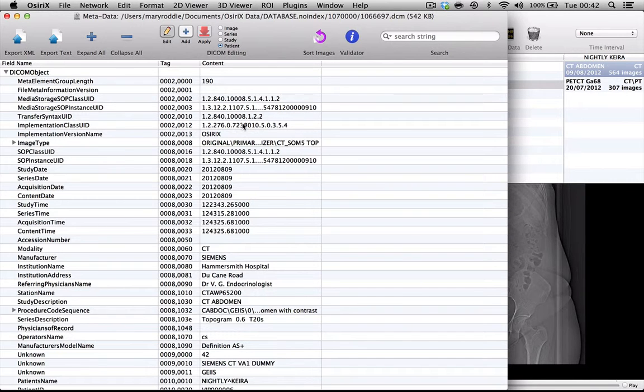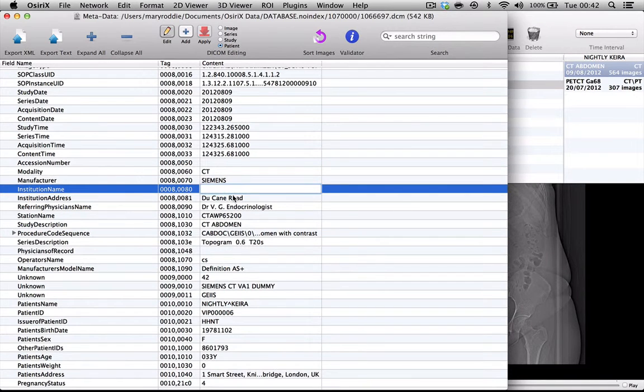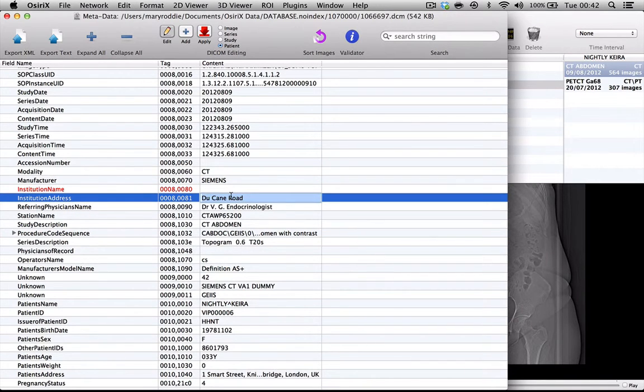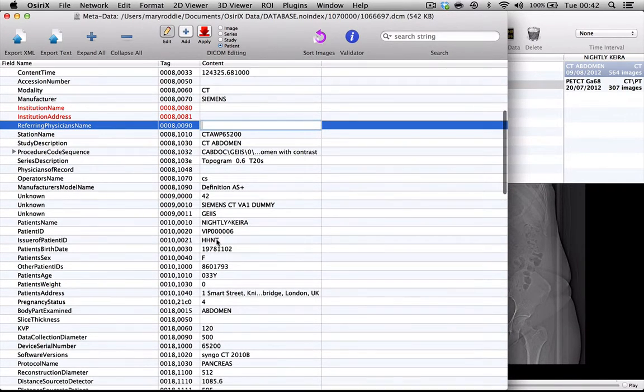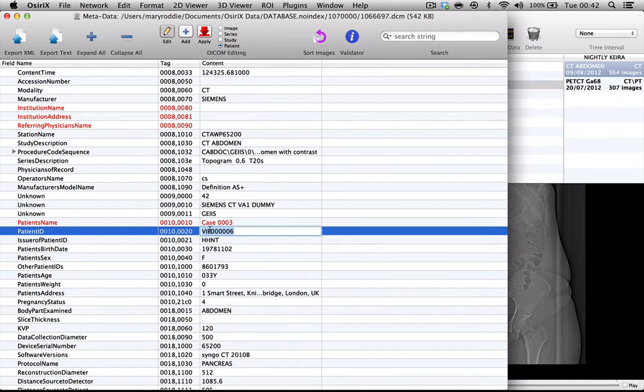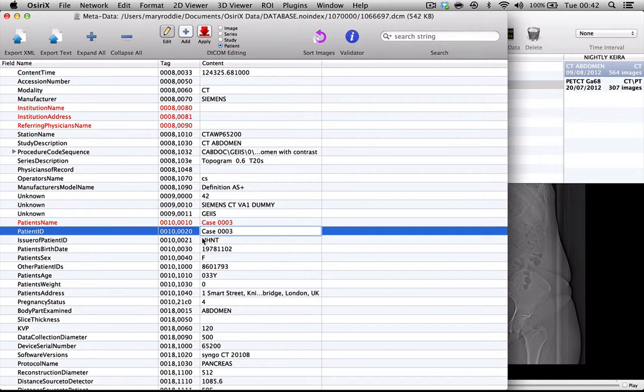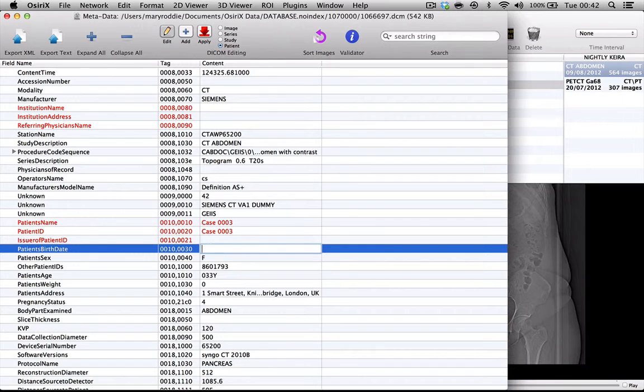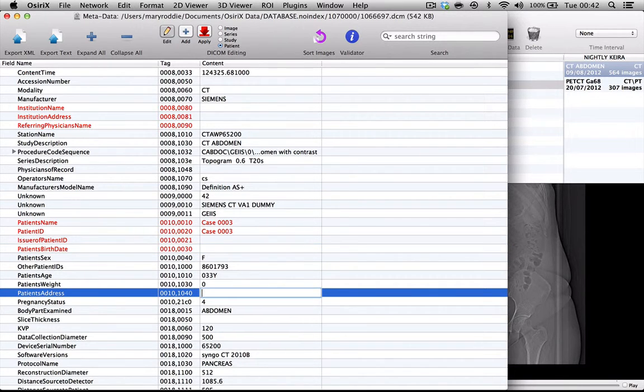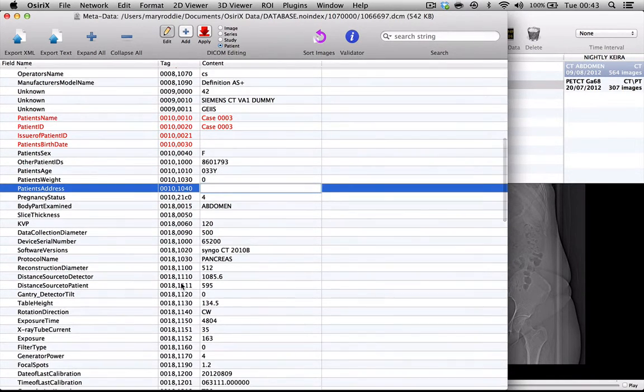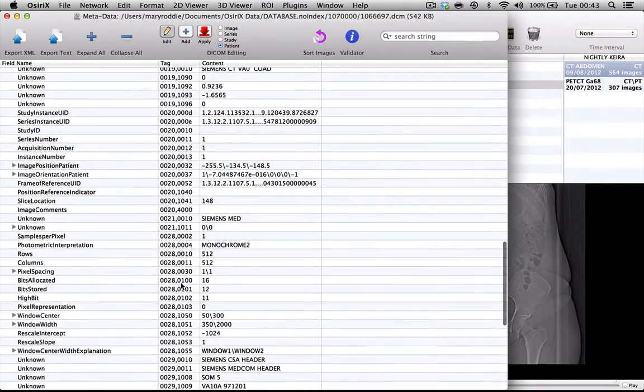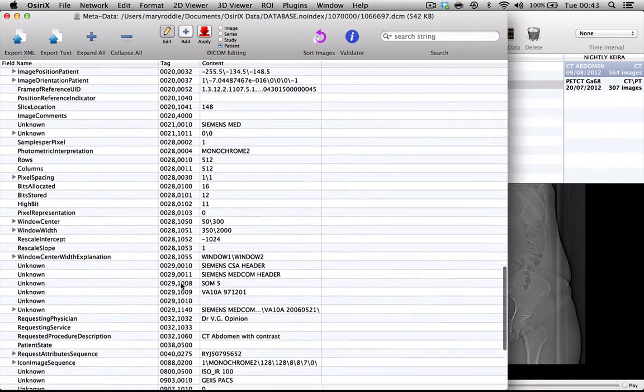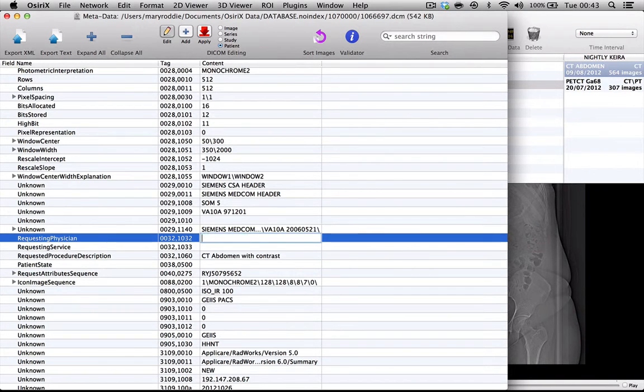I'm now going to go down through the headers, getting rid of any information that I don't want to be there, like the name of the endocrinologist and the hospital and the address. I've now got the patient name, so I'm going to put case 0003 and the same for the ID number 0003. I'll get rid of the hospital name there and I'll get rid of the date of birth and the address. Remember, this is the 0010 fields, which are full of important bits of patient information. I'm just going to look through the rest of the DICOM headers in case I can see anything. There's another doctor's name, I'm going to get rid of that.